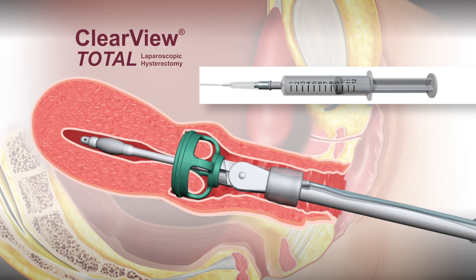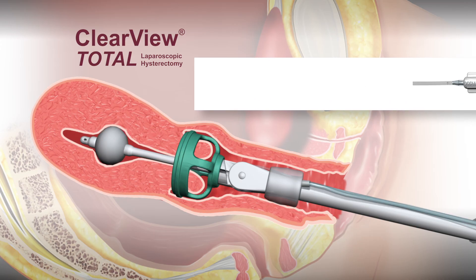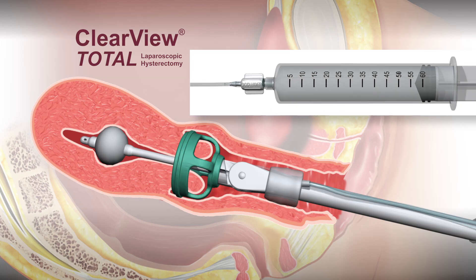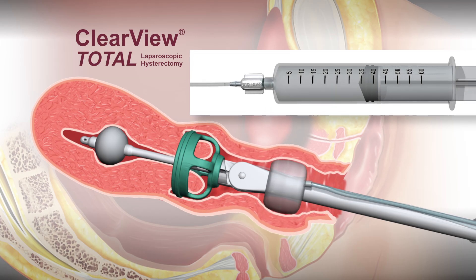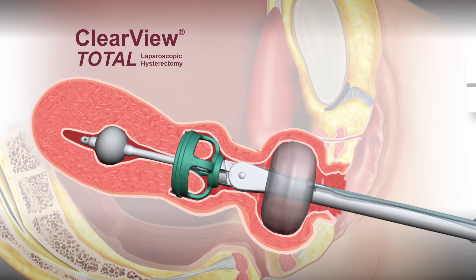After the uterine manipulator and colpotomy cup have been properly placed, the tip balloon is inflated with sterile saline. Then the occluder balloon is inflated with 60 to 120 cc's of sterile saline. The occluder serves as a seal to prevent the loss of pneumoperitoneum once the colpotomy incision has been made.